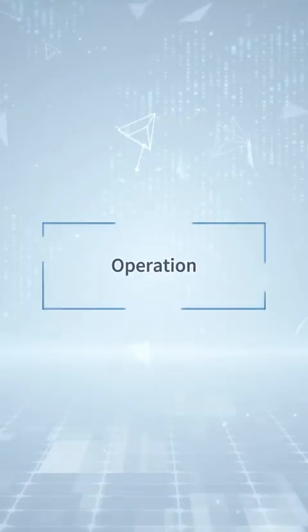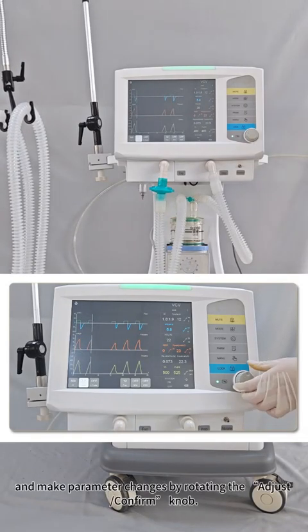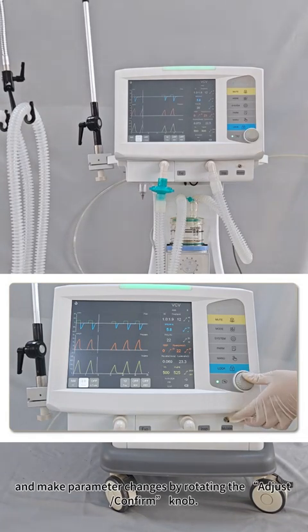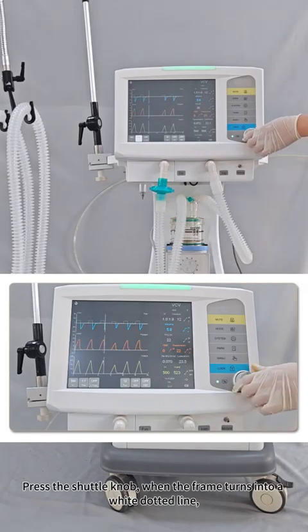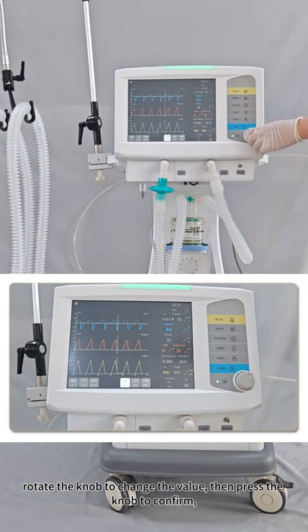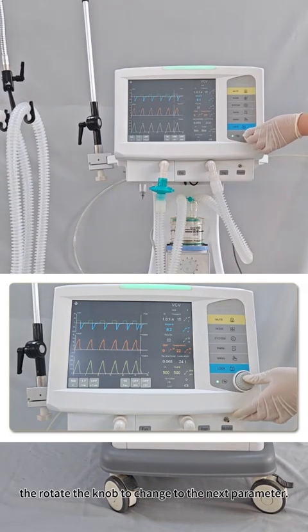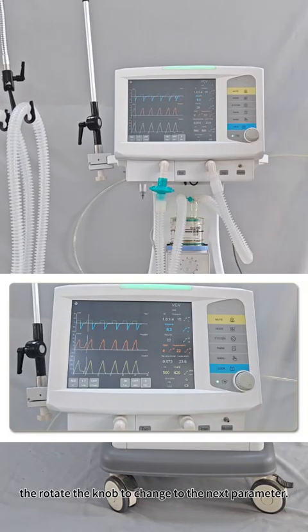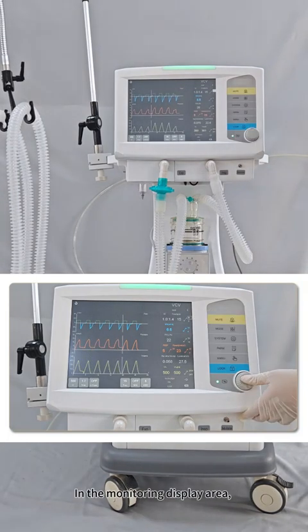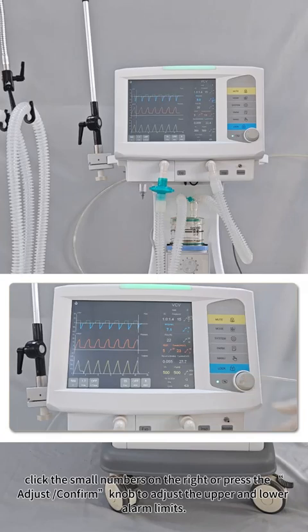Operation. We can press the Adjust and Confirm knob to start parameter settings, and make parameter changes by rotating the Adjust and Confirm knob. Press the knob. When the frame turns into a white dotted line, rotate the knob to change the value, then press the knob to confirm, then rotate the knob to change to the next parameter. In the monitoring display area, click the small numbers on the right or press the Adjust and Confirm knob to adjust the upper and lower alarm limits.